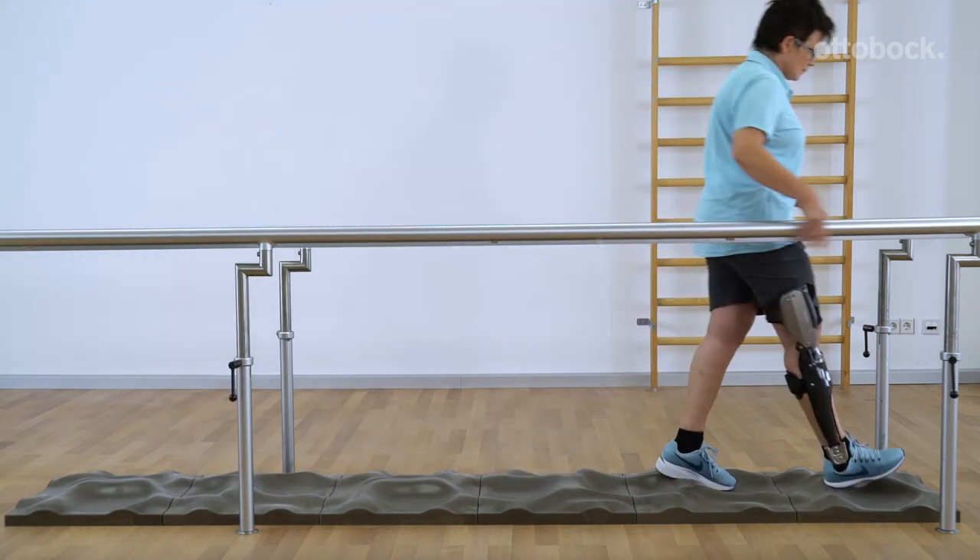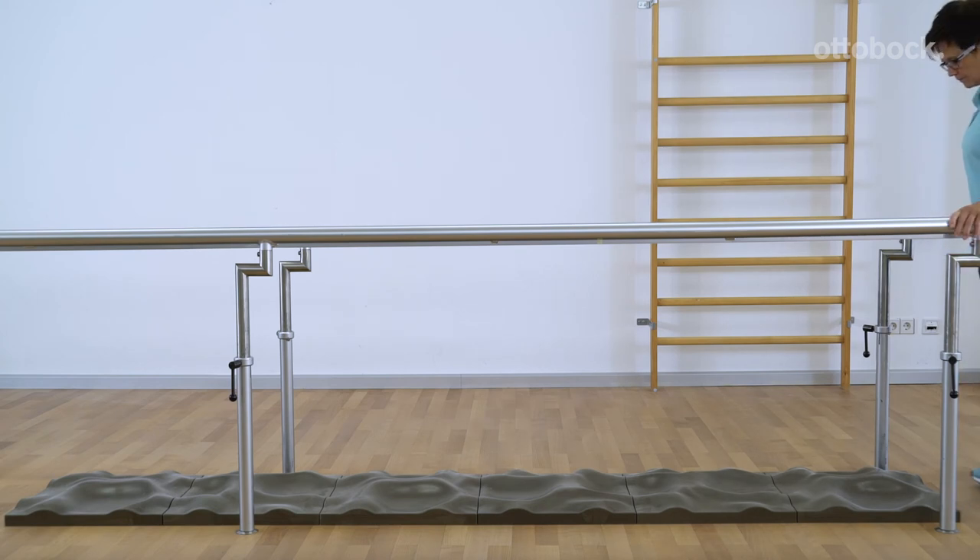Also practice walking on uneven surfaces to prepare the patient for everyday situations.